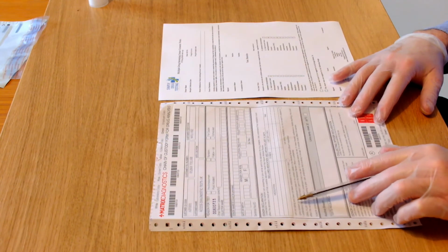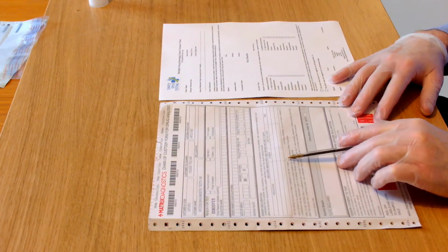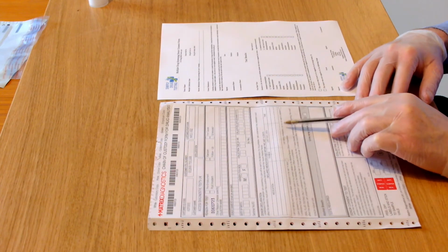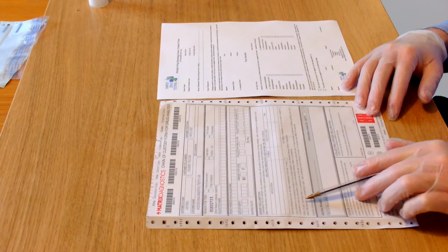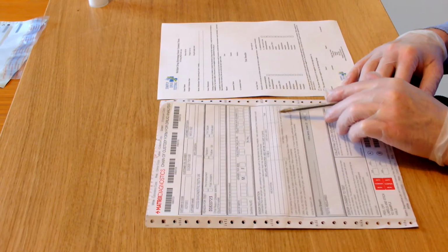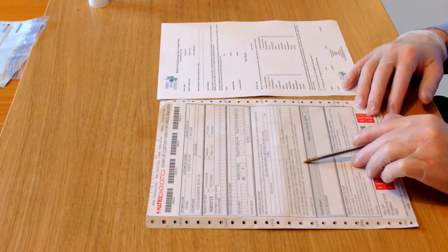Underneath where we list the medication there are two boxes. The first one says I am not taking and have not taken medication in the last 14 days, in which case the donor simply ticks the box in there. Or I am taking medication but do not want to declare it. The donor then signs to say that he's taken medication or that he refuses to declare it, and then he signs the donor statement there.